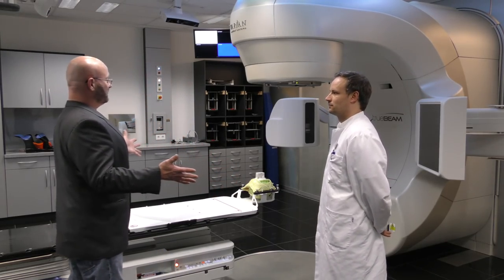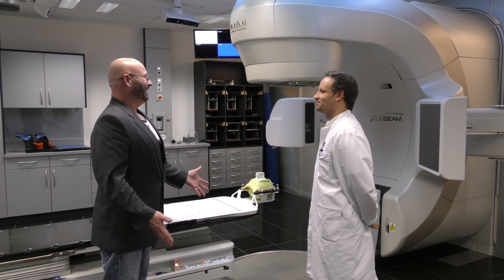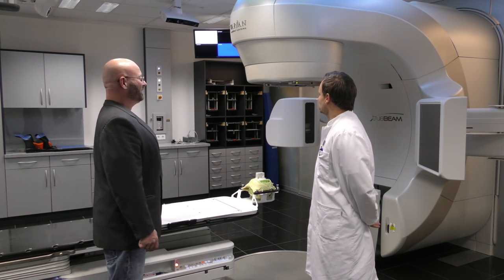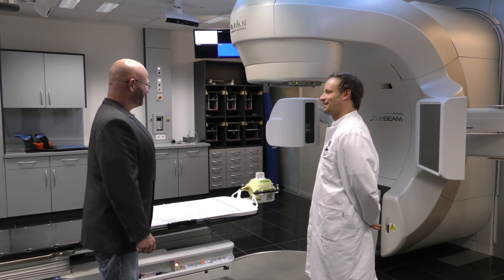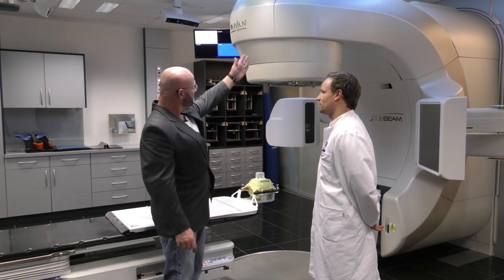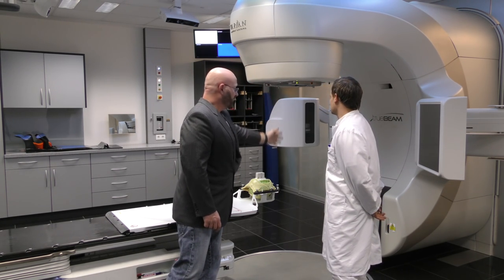This is our linear accelerator — an X-ray cannon, the real thing. It's much different than Star Wars, but probably even more impressive. And this is actually where the radiation is going to be emitted, directed down towards the patient.